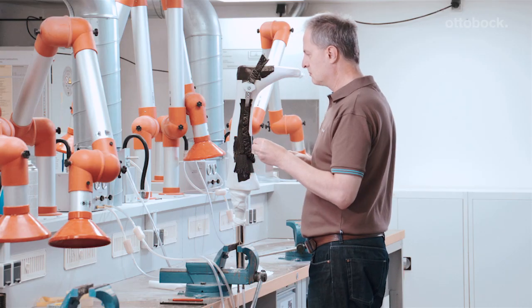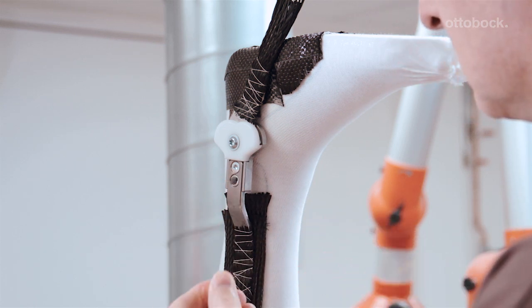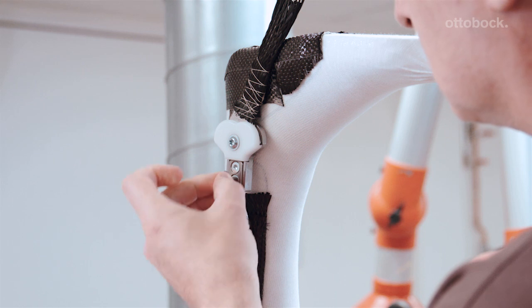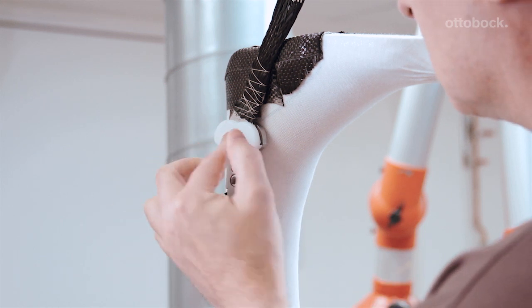To do so, screw the dummy screw connection together with the pyramid adapter in the plaster model. Use plaster band to cover the countersunk head screws in the bar component and the screw connection of the dummy system.